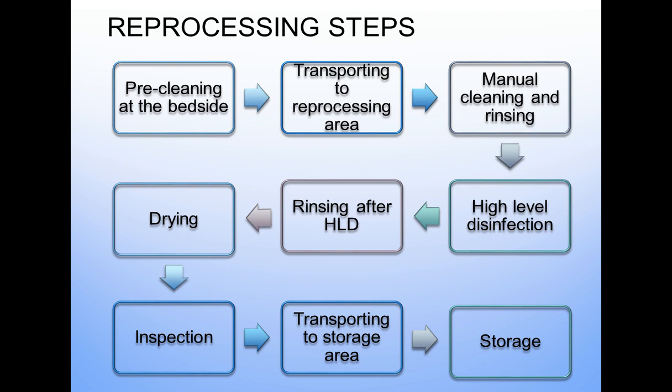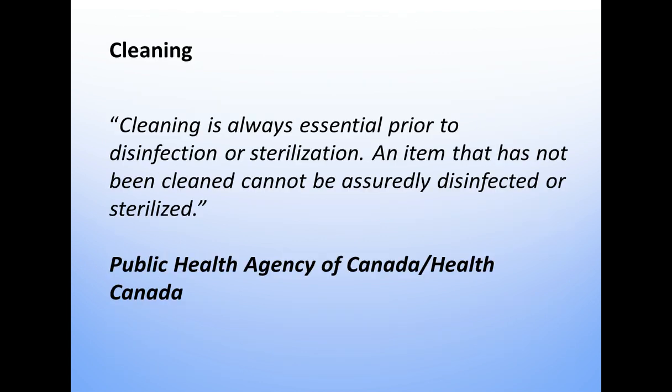Then we move into the high-level disinfection mode. Of course, the devices have to be rinsed thoroughly after high-level disinfection. They have to be dried thoroughly. Then there's an inspection process, and then you transport to a storage area, and of course, then the probes are stored. And I'm going to talk a little bit more about storage further on in my presentation.